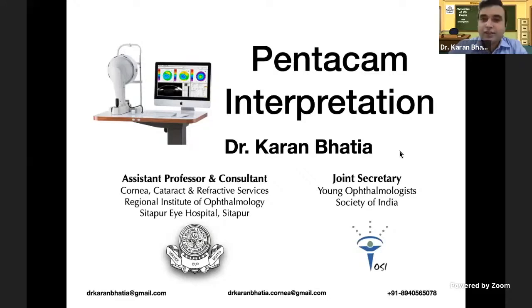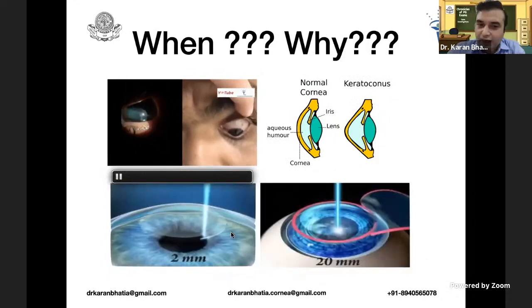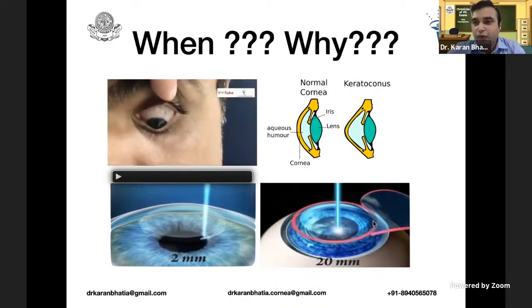My talk is on Pentacam interpretation. When and why do we do a Pentacam? You need to rule out keratoconus. You need to do it before any refractive surgery — this includes SMILE and LASIK. You also need it for evaluation of any kind of astigmatism, particularly when planning for a toric IOL. You can also use it for post-keratoplasty cases when planning suture removal. The main indication is the keratoconus screening.